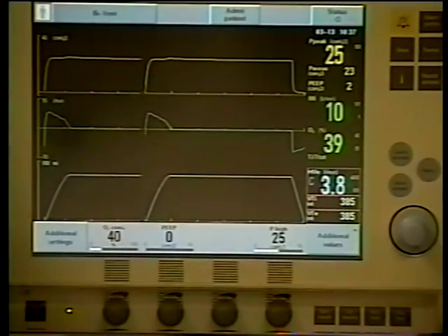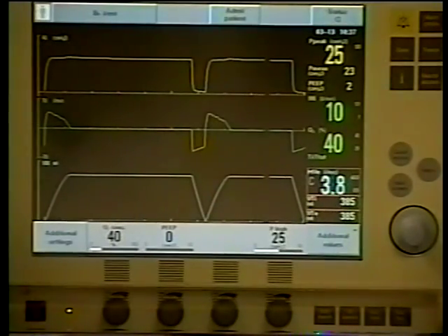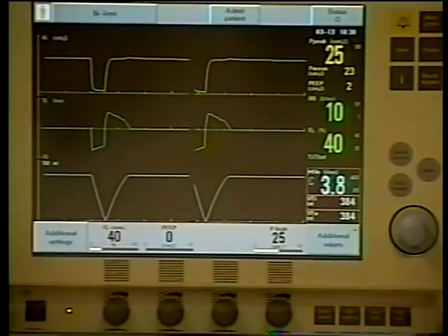They may end up decompensating. They may not do it right away. They may do it right away. But they may decompensate over time because they're just not ready for that huge drop in mean airway pressure. The same can be said for bivent to conventional.